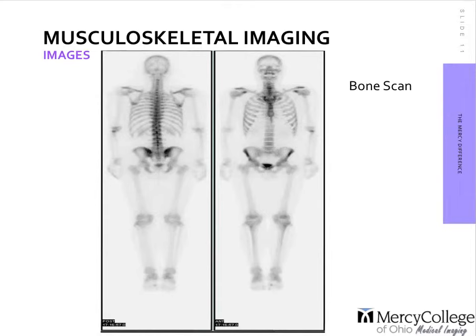After the radioactivity is injected, a little bit of the residual will stick around in that part of the vein. Maybe a little bit of it went outside into the soft tissue. So more than likely, that's what that little area is. If you look into the shoulder joint regions, you can see little dark spots on both sides. More than likely, those are probably arthritic changes.